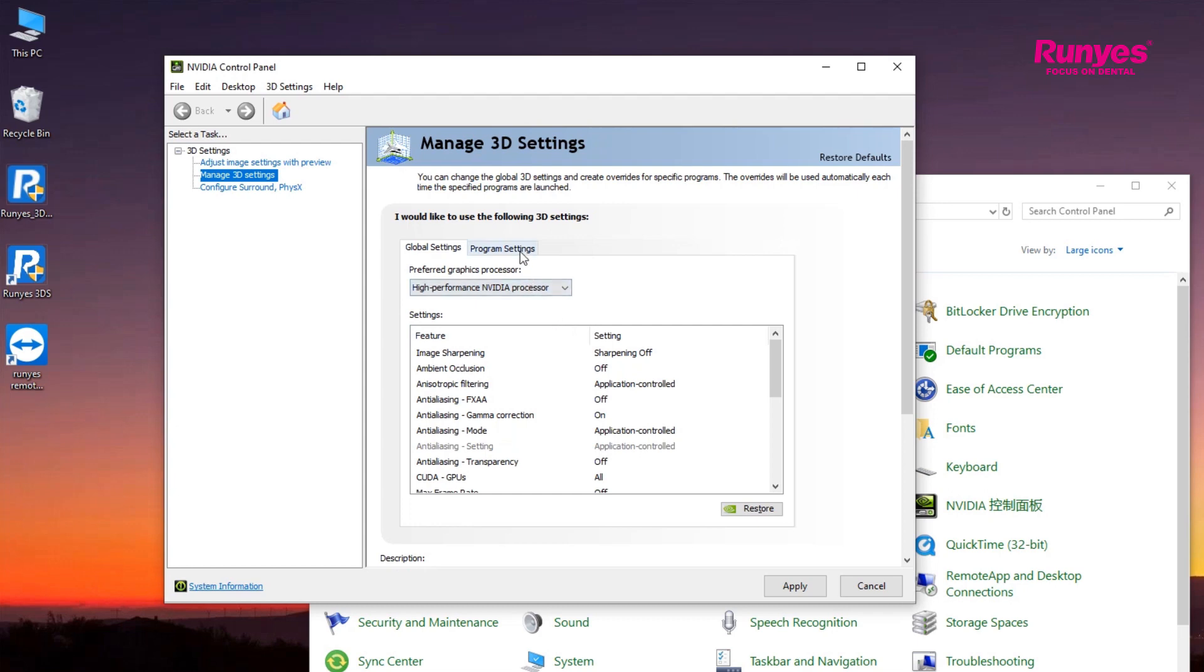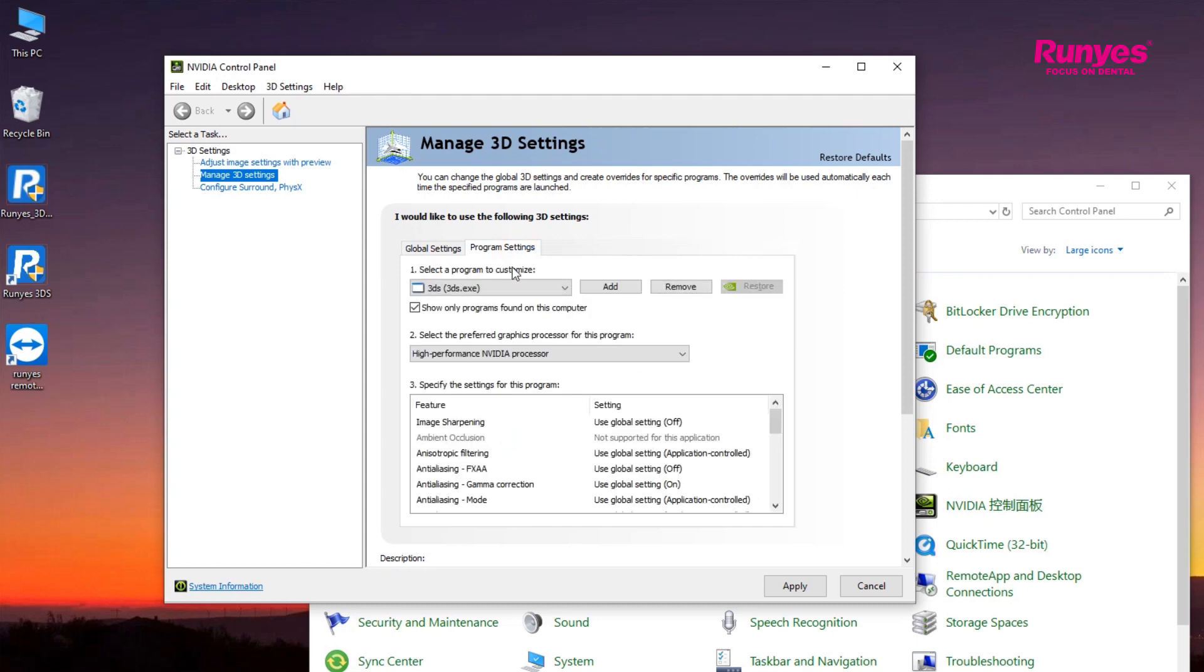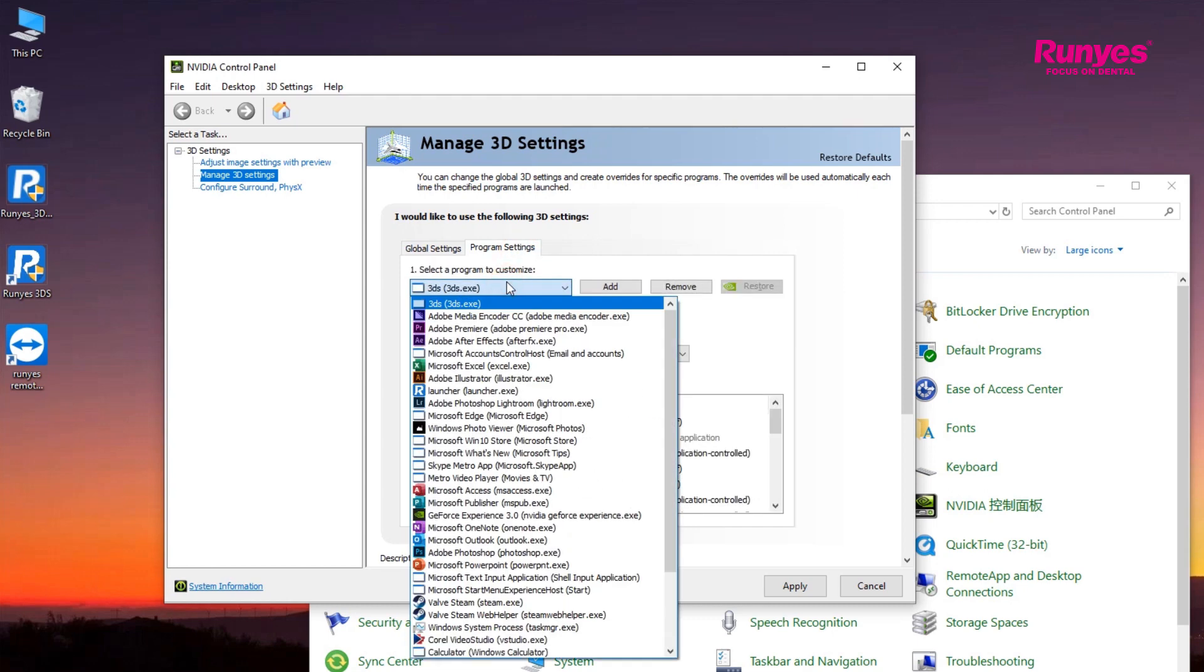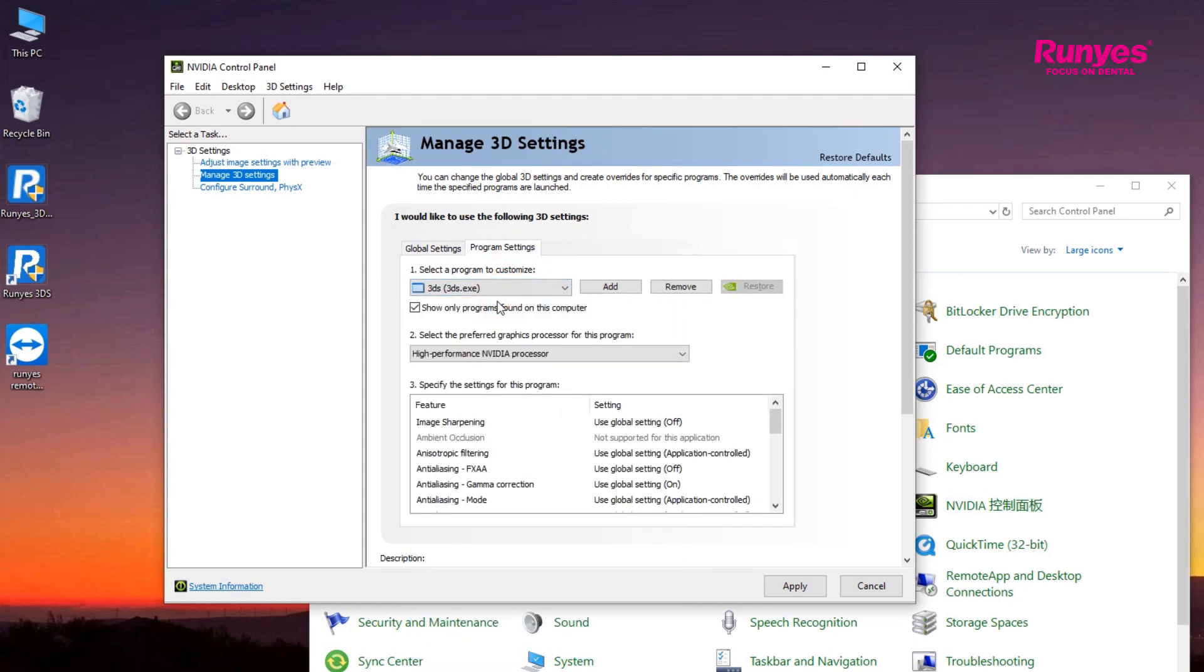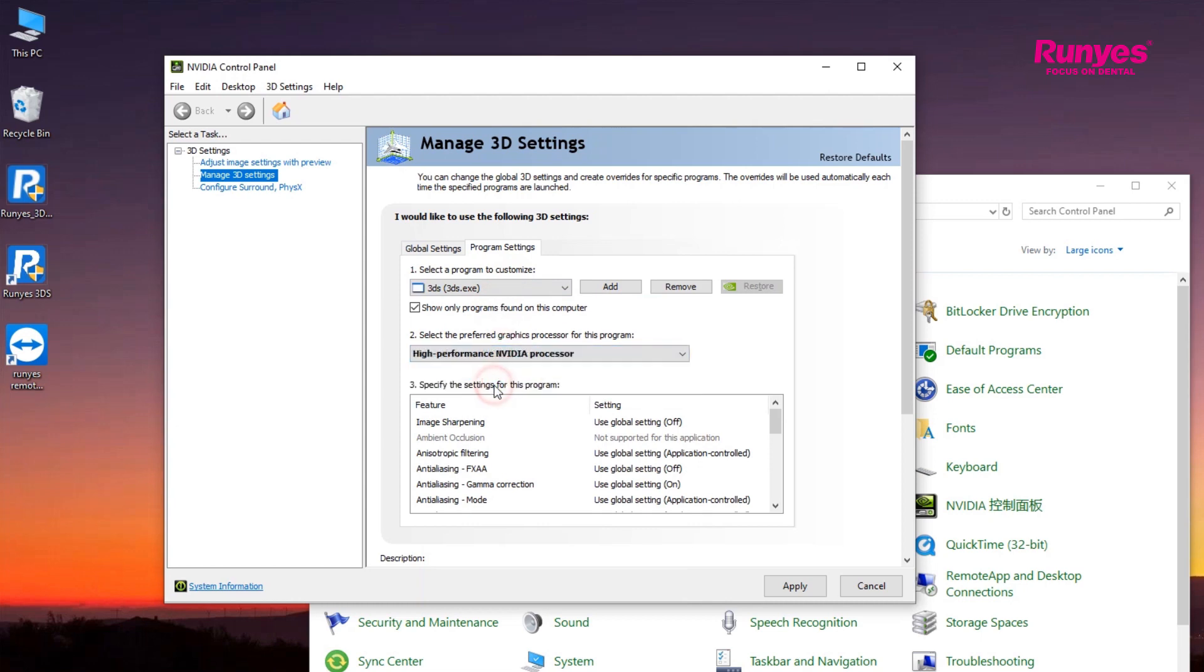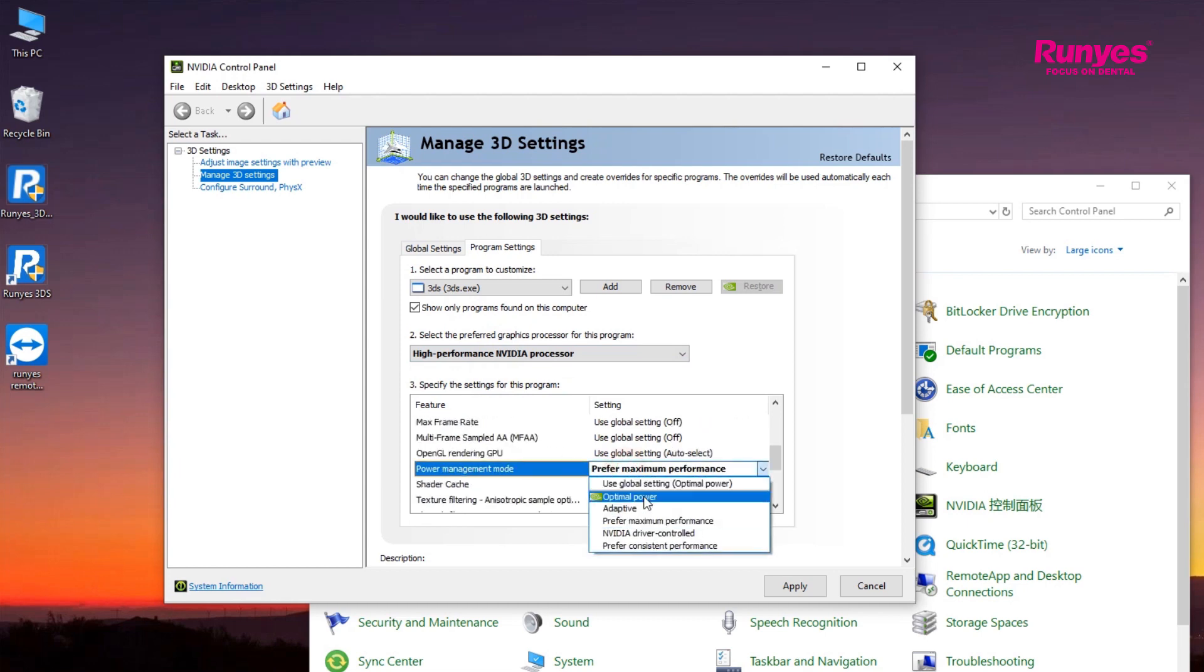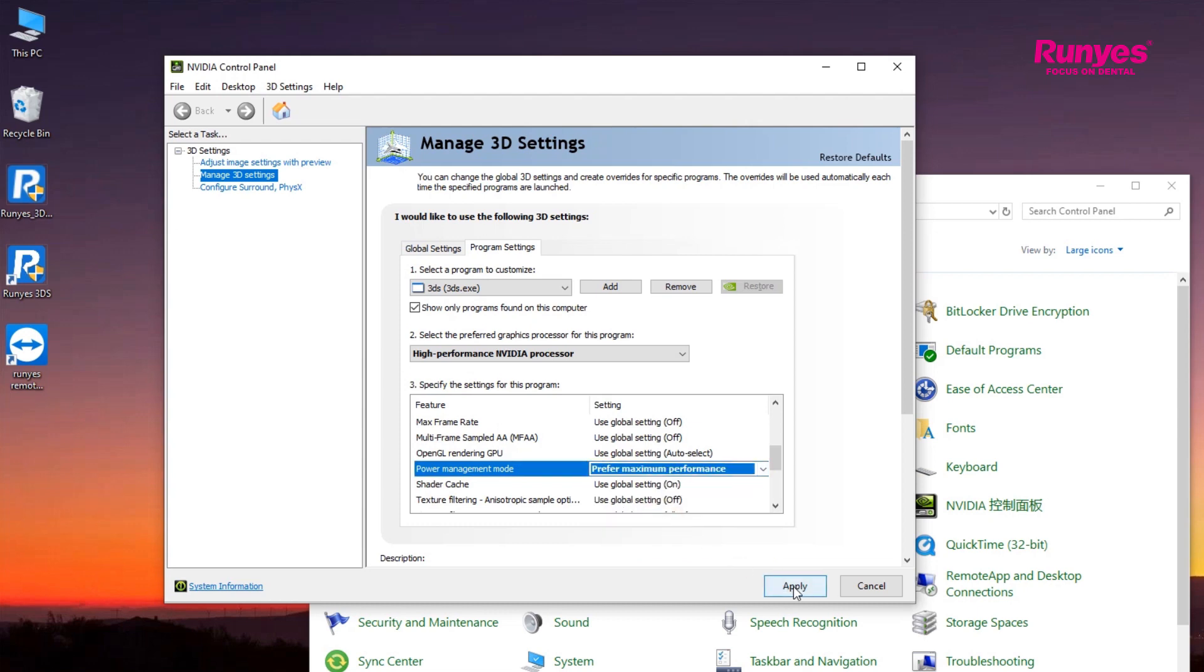Then click Program Settings. Select the 3D program. Select High Performance NVIDIA processor in the Preferred Graphic Processor option. Then pull down the menu to find the Power Management mode and select Preferred Maximum Performance.